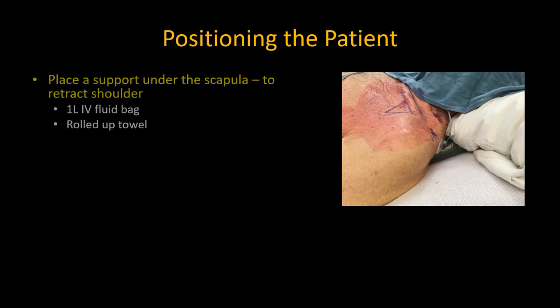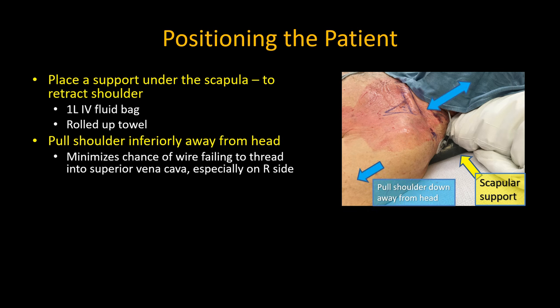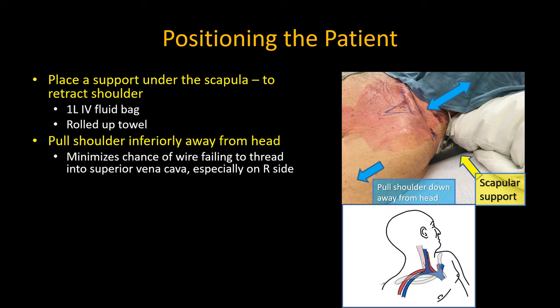A few things will make things easier. First, placing a small support under the scapula helps to retract the shoulder out of the way, and we will shortly see why that is important. Second, pull the shoulder down away from the head, which minimizes the chance of the guide wire not threading into the superior vena cava. I'm not sure why this maneuver works, just that it does — perhaps by straightening out the vein.